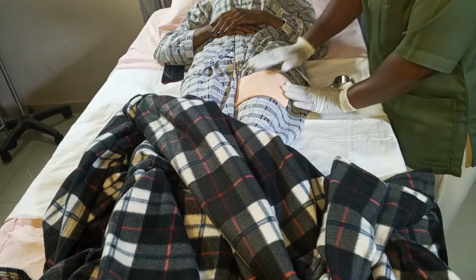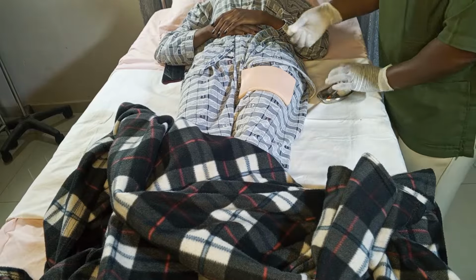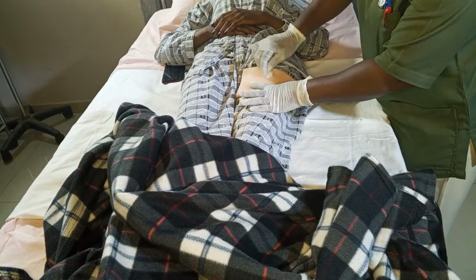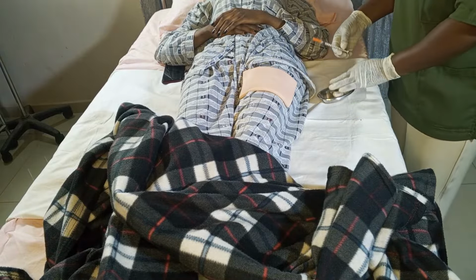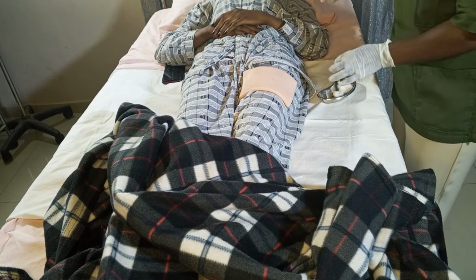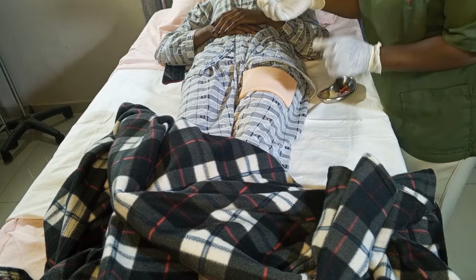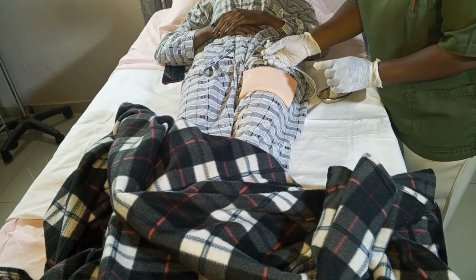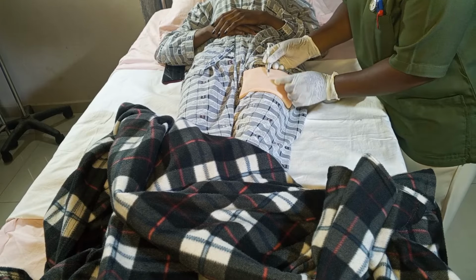I'm here to administer the medication, the one I have explained to you, and I'm going to administer it on the thigh of my patient, right? So you expose the patient's thigh and then clean the area with your spirit swab. After cleaning it in a circular motion, you remove the cap, also discard it, and then you pick your dry swab and then you inject this patient subcutaneously at 45 degrees, right? You inject the patient, right?